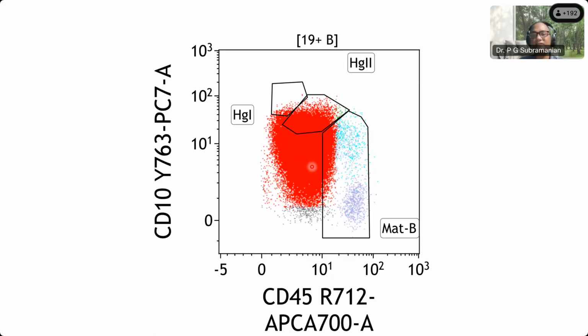So this again answers the same question, why we are calling it a blast. We are calling it a blast based on two or three facts. One is the morphology, which shows that there are hardly any normal cells. Second is the immunophenotypic abnormalities, which tell you that they are not a normal phenotype. So these two combinations we use when we try to say whether there are normal or abnormal cells.